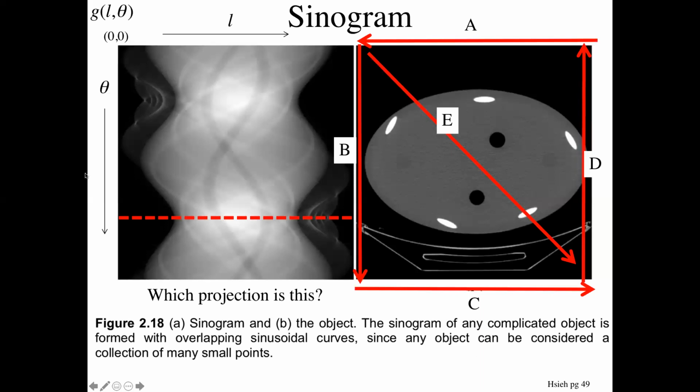Theta gets from 0 to 2 pi. L is just the full length of the detector, we'll say, is this length here. So the other feature we can look at is this gobbledygook here, right? There's some stuff here. That's this, right? And so one assumes that if L is low here, high here, it's low here, high here, all of this stuff is on this side. It's this view that we're looking at.